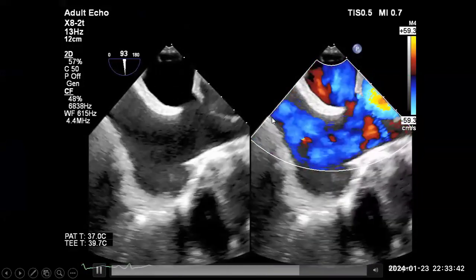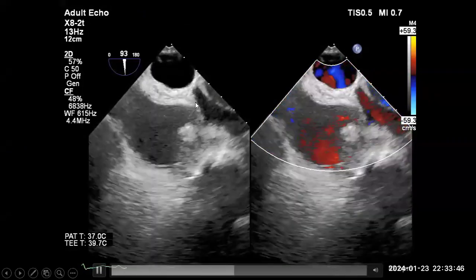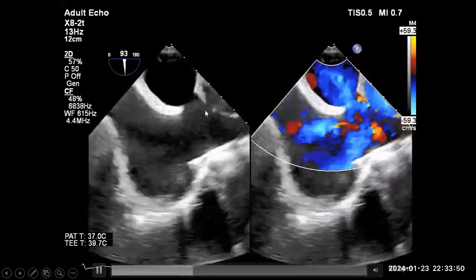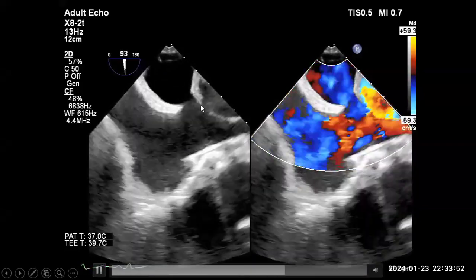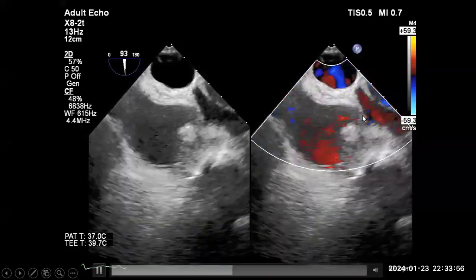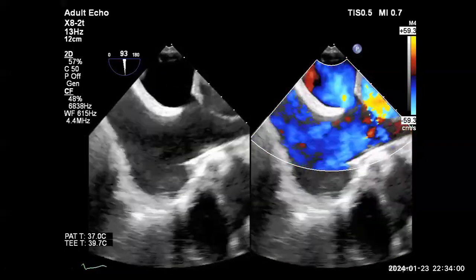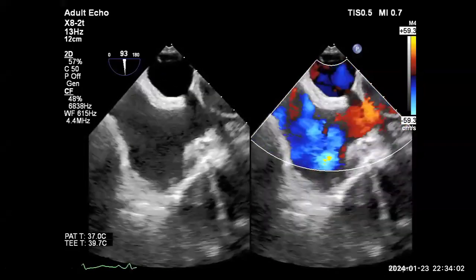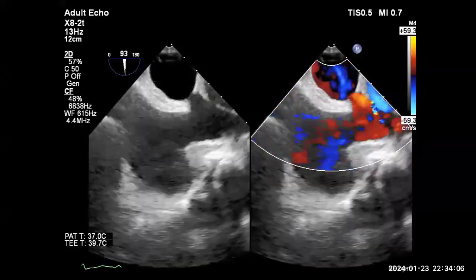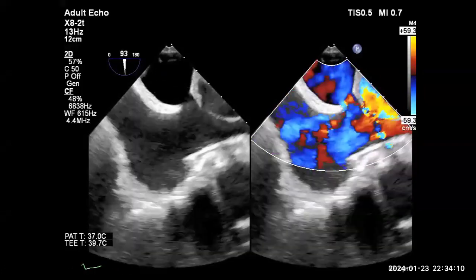Here, after we open the SVC, we can see clearly there is a sinus venosus, superior SVC shunt with bidirectional flow. Okay, so what's the next step that you need to check to explain or justify your right side dilatation? Other than this, you need to check for the pulmonary veins.